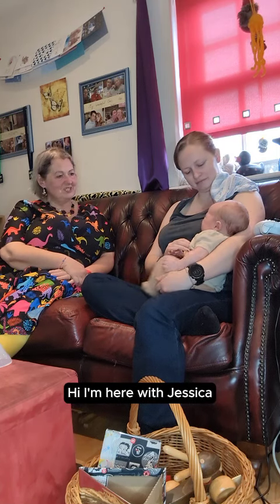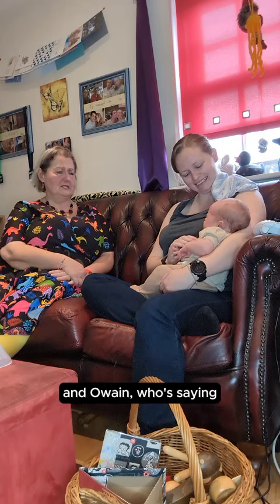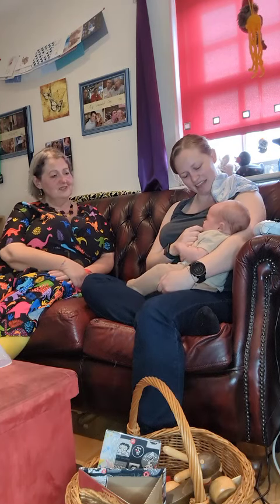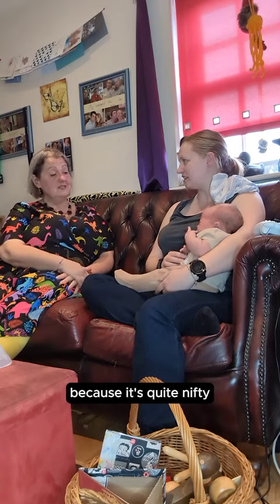Hi, I'm here with Jessica and Owain, who's saying he thinks he's still got a bit more room for some more milk. So, tell us a little bit about your pumping machine, because it's quite nifty, isn't it?